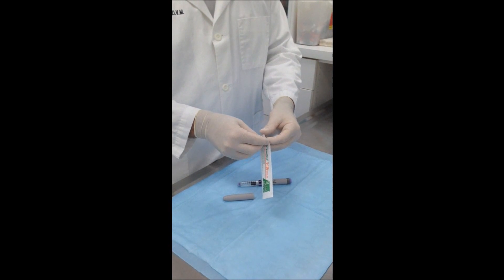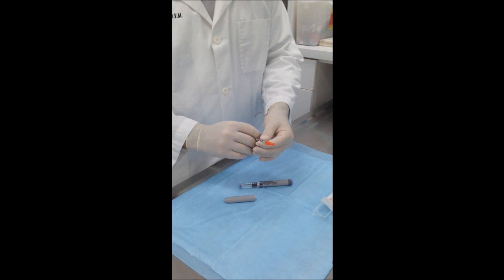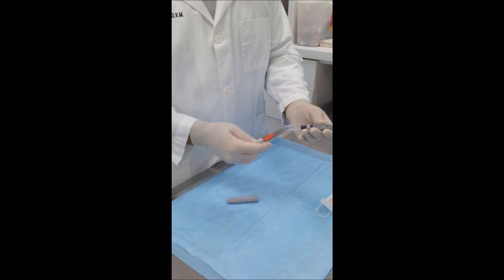In our instance we're going to use the disposable syringe to draw the insulin out.